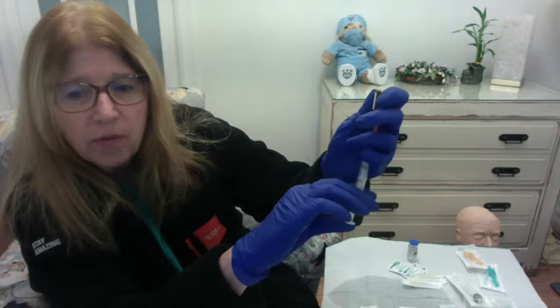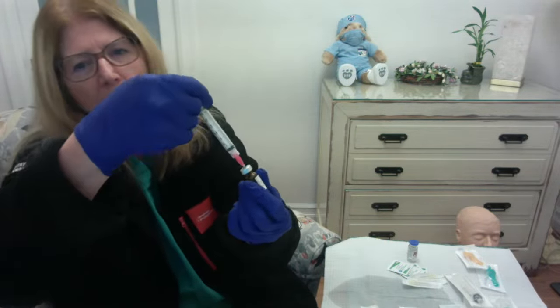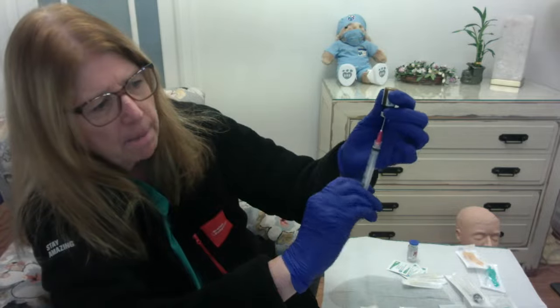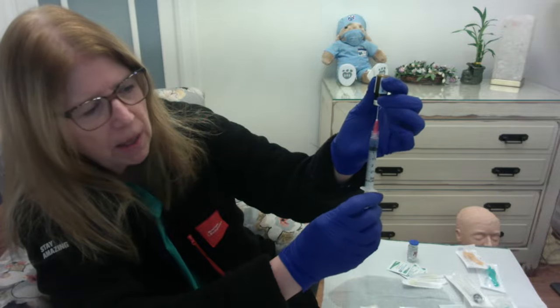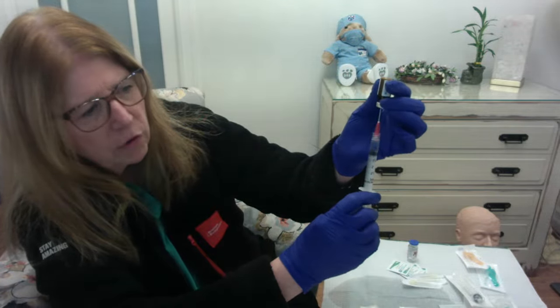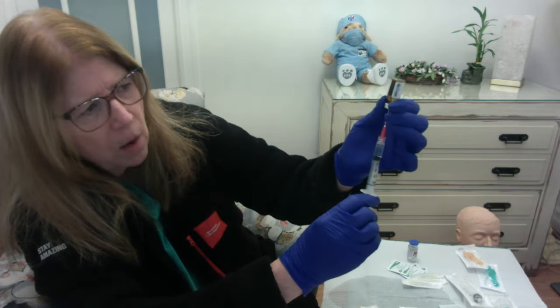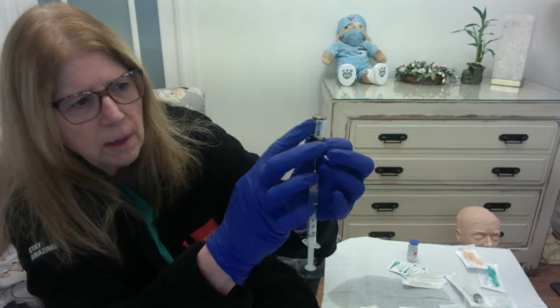And that's because of that air that I put in there. It's pushing the plunger out so that it's filling with my medication, right? So there's my medication coming back into my syringe. Now I may need to give it a little bit of help.